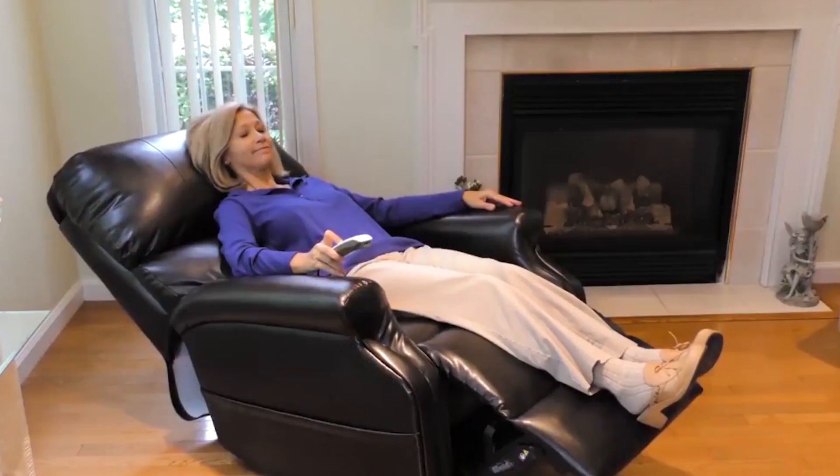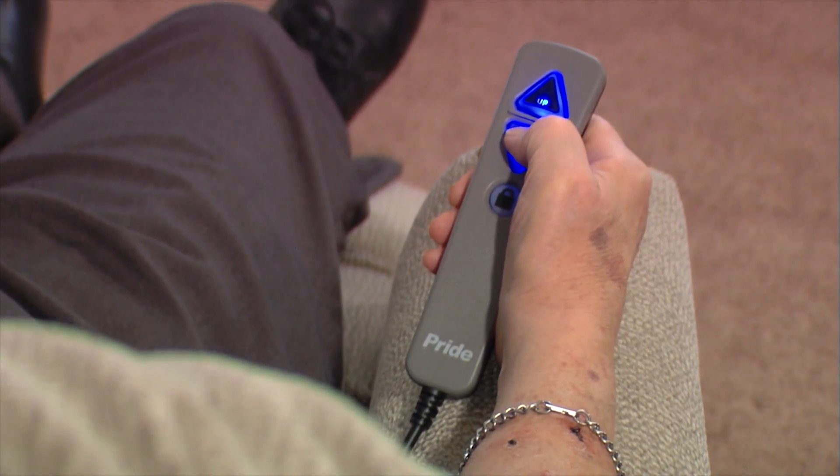So you've purchased your lift chair. There are a few basics to understand about your product. Every lift chair has a hand control. This device allows you to control the many features of your lift chair. At the basic level, this device will allow you to control the lift and recline of your lift chair.